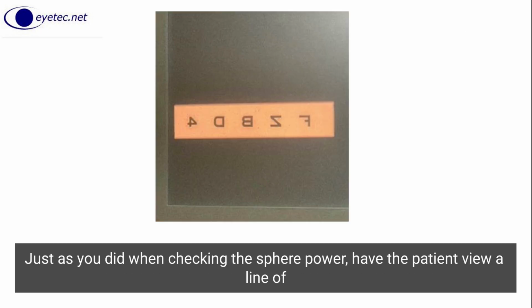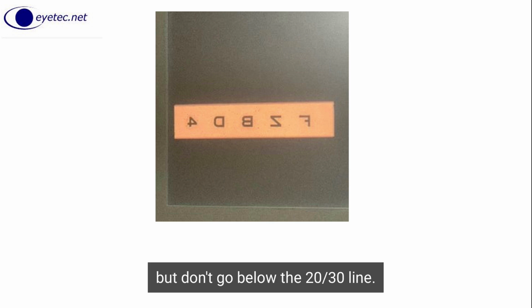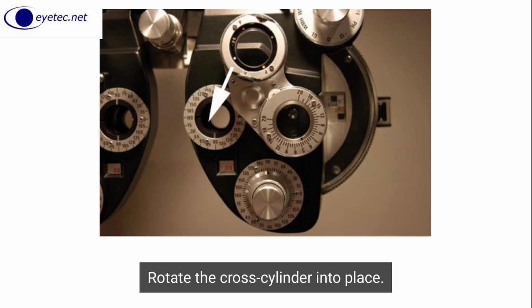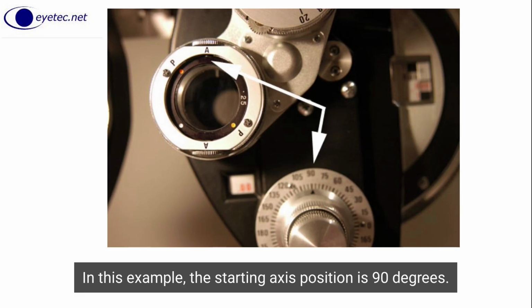Just as you did when checking the sphere power, have the patient view a line of letters that can be read, but is one line above the line the patient has trouble reading. But don't go below the 20-30 line. Rotate the cross cylinder into place. Begin by lining up the A's with your starting axis position. In this example, the starting axis position is 90 degrees.